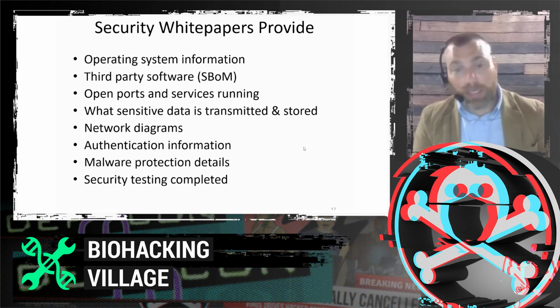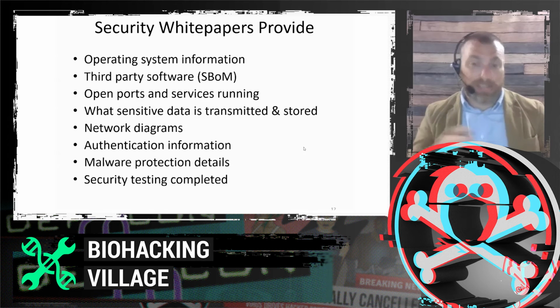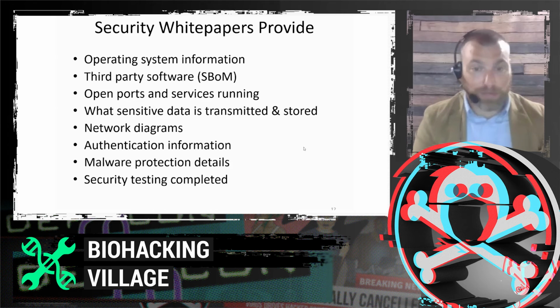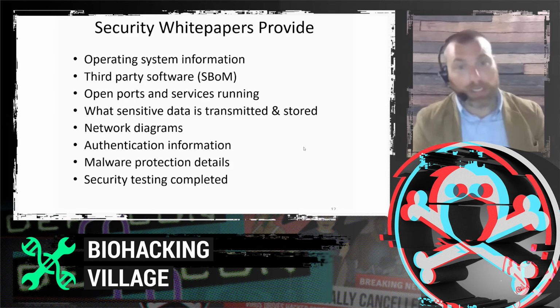They'll probably give you a network diagram of how the device is meant to live in your network, so you can see that. They talk about authentication, malware protection, and security testing, if security testing has been completed. So if the device has gone through a rigorous secure development process, there should be notes on that.